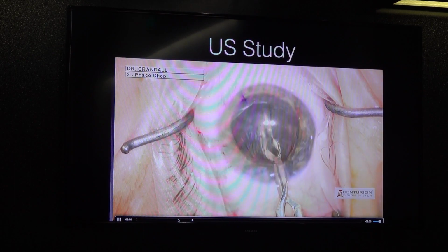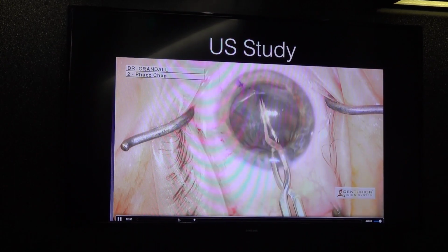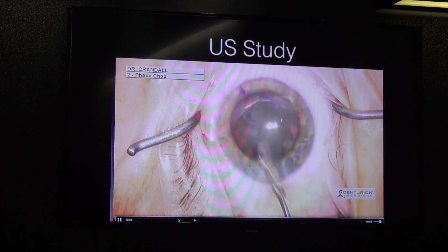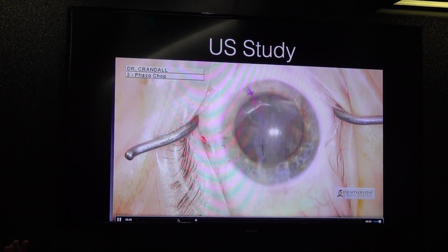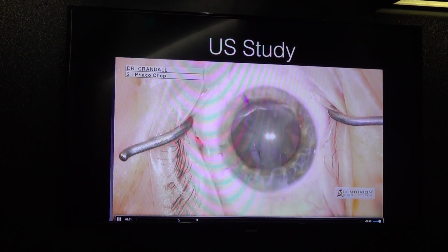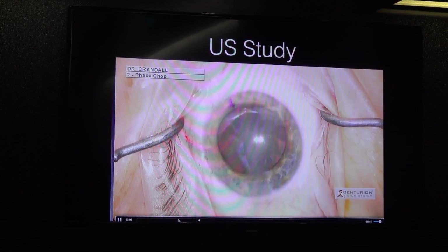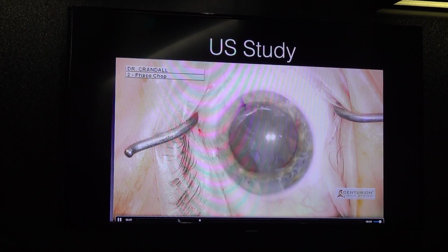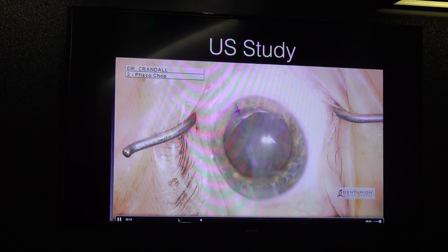And what this does for us internationally is it allows us to reverse teach folks about Phaco. What do I mean? Everybody here knows that there's no inconsequential step to Phaco, right? A bad incision, a bad stab, a small rhexis, all of that interferes with it. And when you're trying to teach someone, it's cumulative.